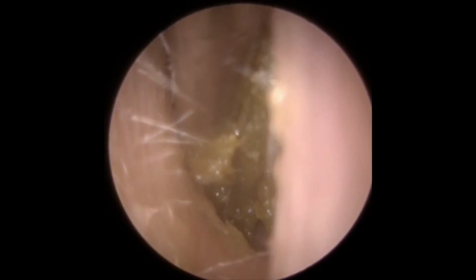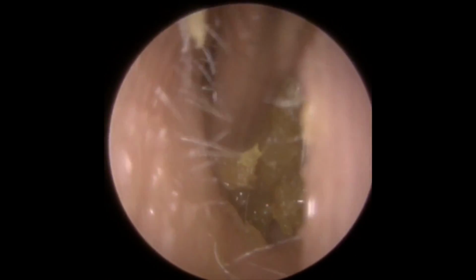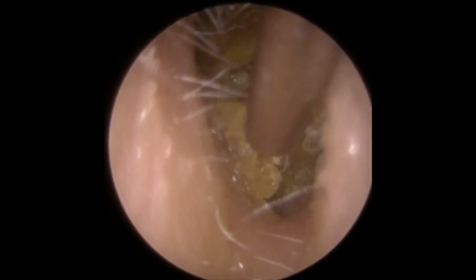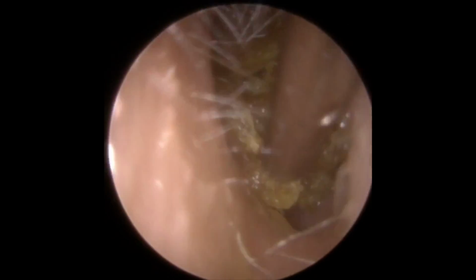Back in with the suction tube again now, clearing up any looser bits of debris, breaking away any smaller pieces that have just started to chip off the main bulk of the wax there.